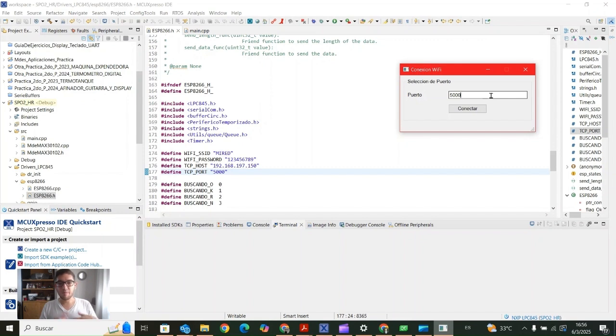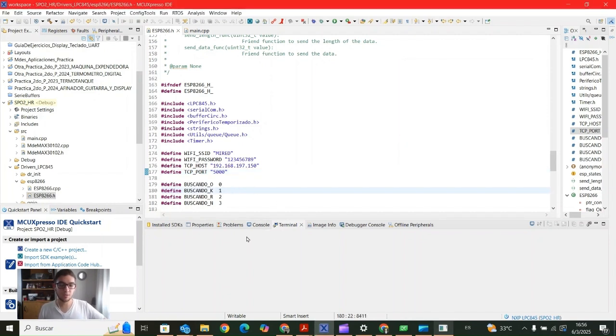Any movement of your fingers, or if you touch the sensor, the screen of the sensor itself, or the distance between your finger and the red light of the sensor may affect the measurements. Another thing is that the sensor turns on after the connection is established, so we are going to do that. Nothing is measured until the entire connection is established.